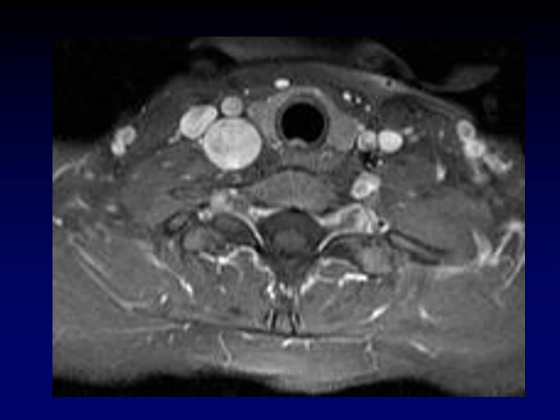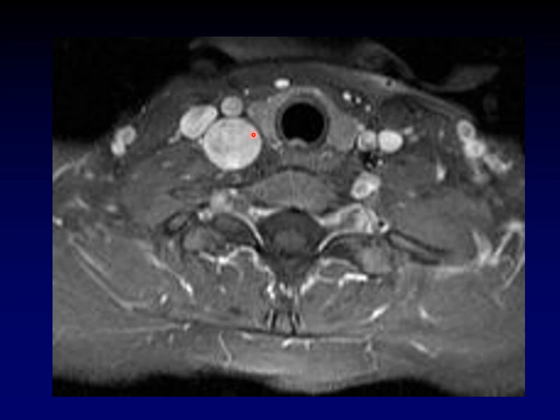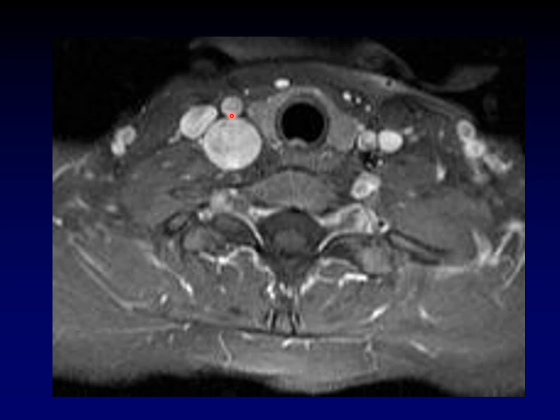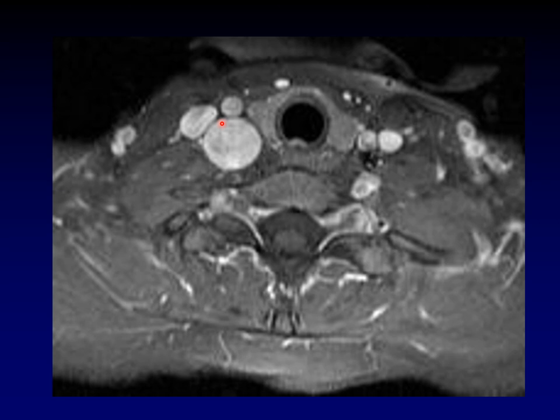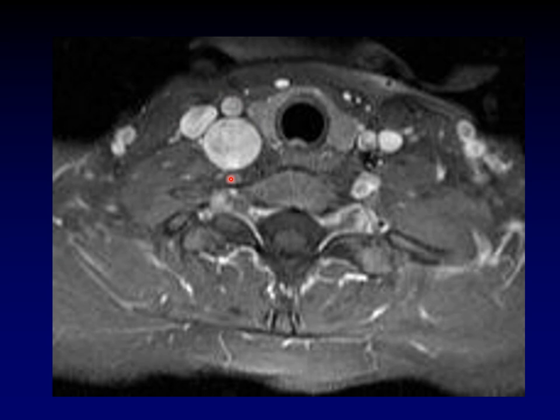Here's a contrast-enhanced fat-suppressed T1 MR. You might be inclined to say there's a big jugular vein — it's not. There's the jugular vein, and there's the common carotid artery. This is a mass sitting behind the common carotid artery and the jugular vein, right in between them — exactly where we expect the vagus nerve to be running. This is a schwannoma of the vagus nerve, and we place it within the carotid sheath. For more examples of vagal schwannomas, see the cranial nerve lectures.